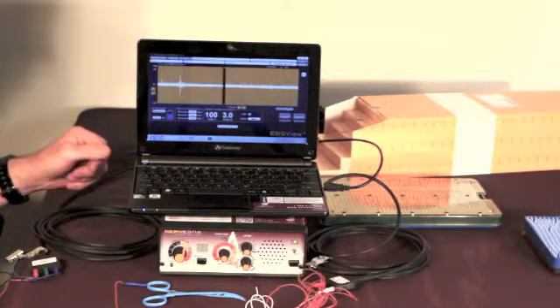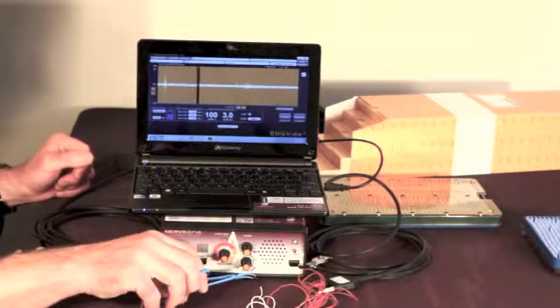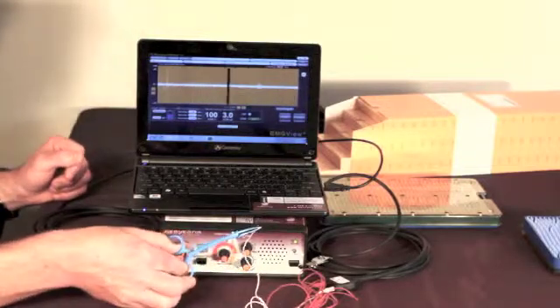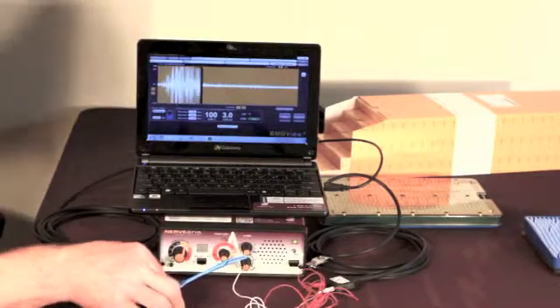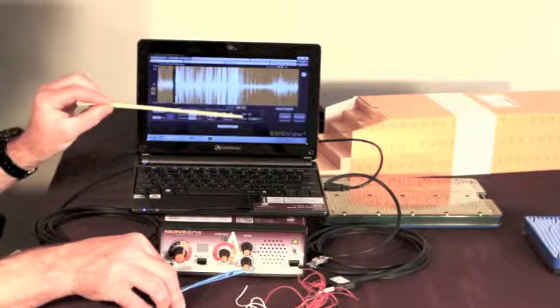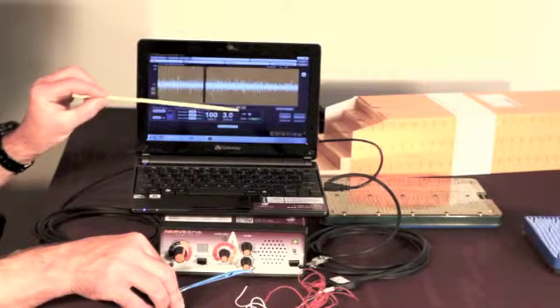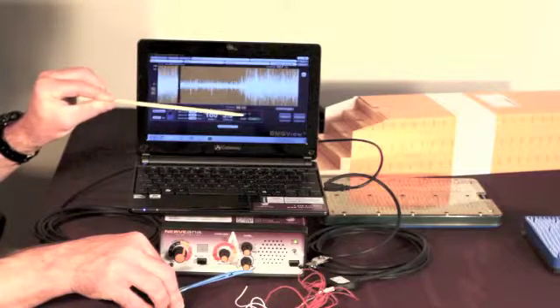Now I want to show you what it looks like when you're stimulating. So I'm going to go ahead and connect the probe to the needle stimulator return, and so I get the sound when a stimulation is being delivered. And as you can see, I'm getting a green indication of full stimulation delivered, and when I flex my forearm, which is being monitored, I get a CMAP and that turns red.